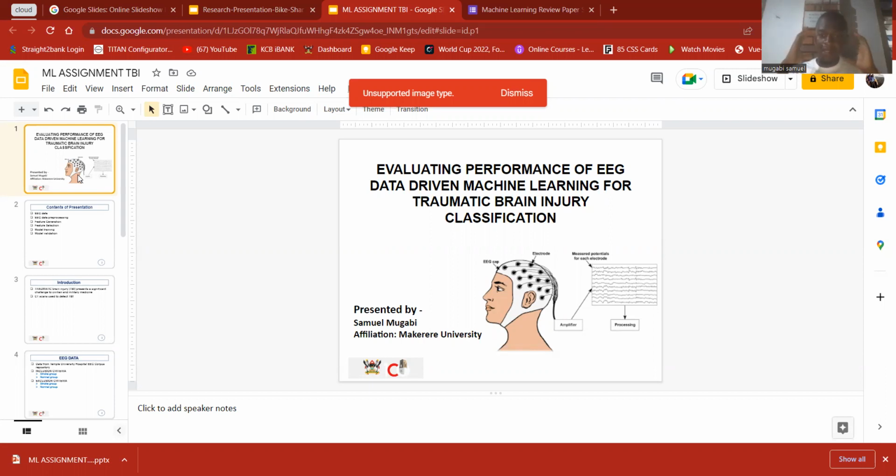And in this study of brain activity, this machine is placed on someone's head, and you can see these are electrodes that are connected to the electroencephalogram that generates these signals. Later, we shall see how these signals are classified. There's gamma, beta, alpha, mu, depending on their frequencies.